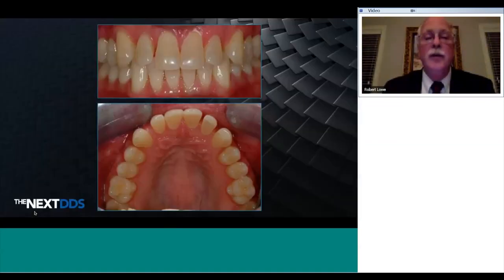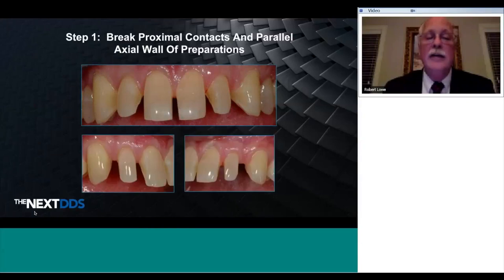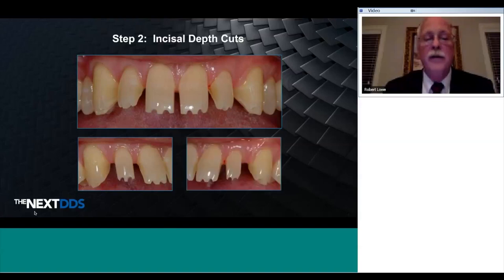Now, sequential preparation, this is an aesthetic case. We've got diastemas, we've got width length, we've got tooth width discrepancies that we're dealing with. So step one, I'm breaking all the proximal contacts. We have diminutive lateral incisors, so we use all of our knowledge of smile design and golden proportion and those types of things. Incisal reduction, I said, remember, 1.5. Use a depth cut of 1.5 from a cylinder burr.